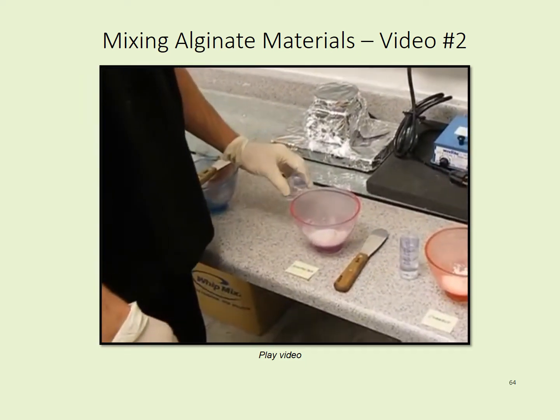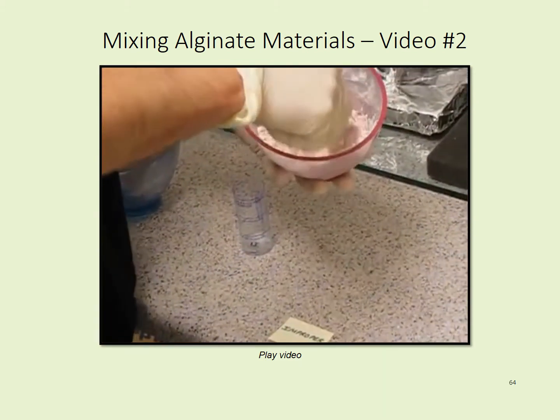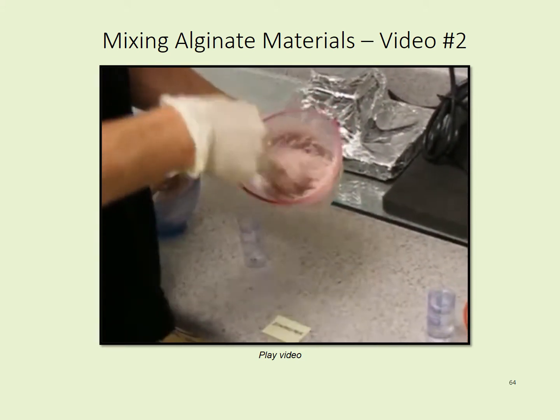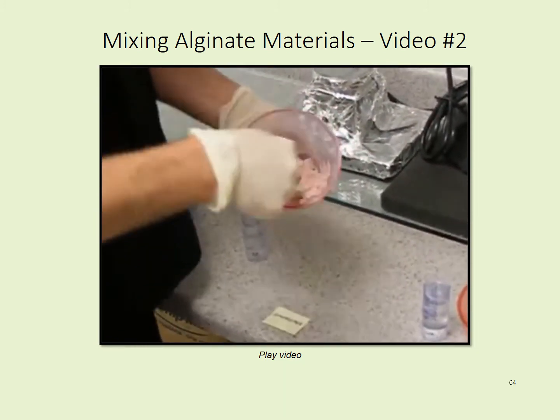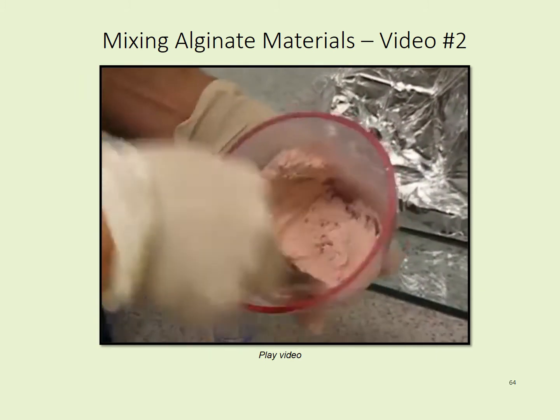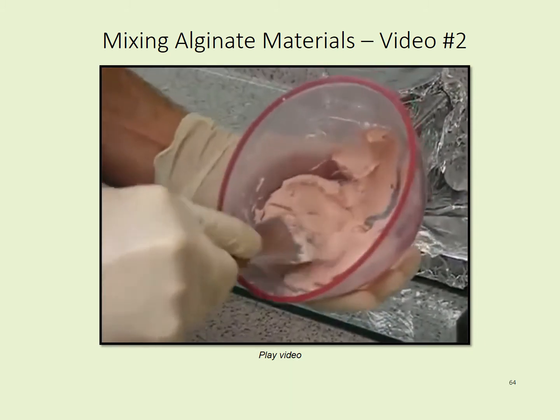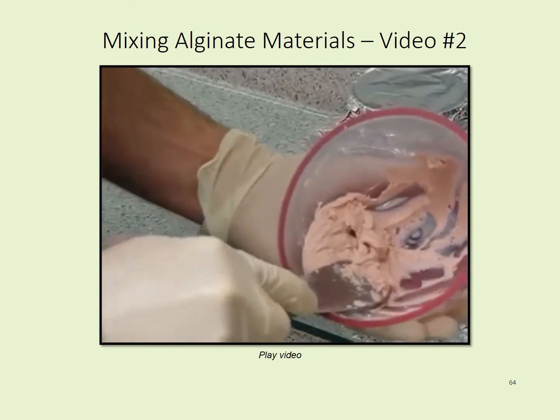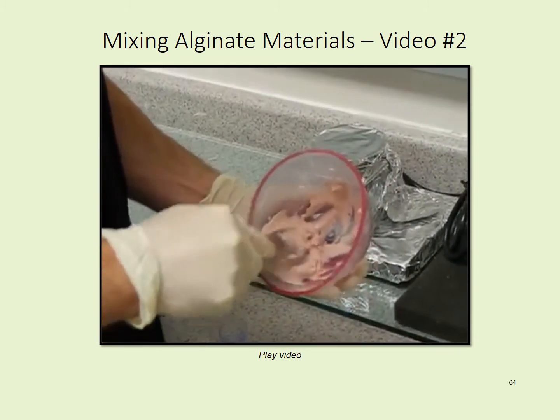Improper mixing. I often see students or people who are initially getting used to the idea of mixing alginate. They will thoroughly wet the material, and they'll either just continue to stir like so, thinking that the material will get a homogeneous mix, or they will take the spatula and pat it, or do some sort of a suction motion like this, expecting it to work. And as time goes on, the alginate starts to set and the mix is not properly done.